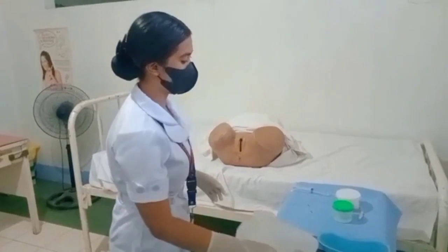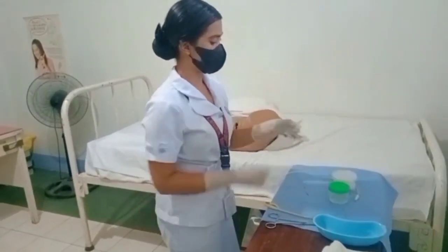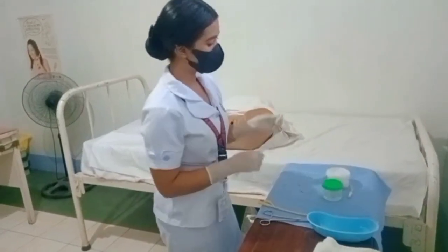And next, we will attach the syringe and test the balloon by instilling the sterile water and deflating, withdrawing the water.